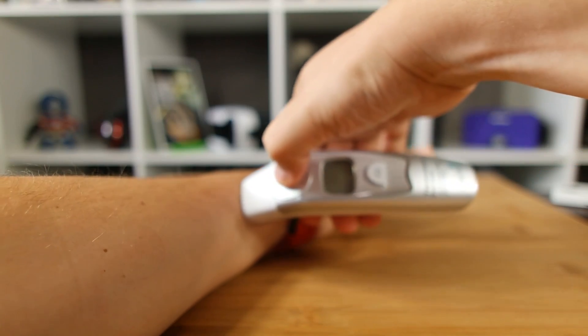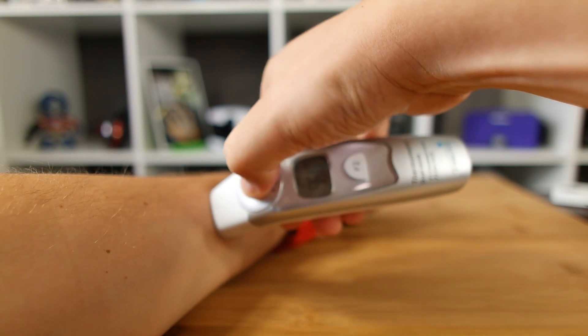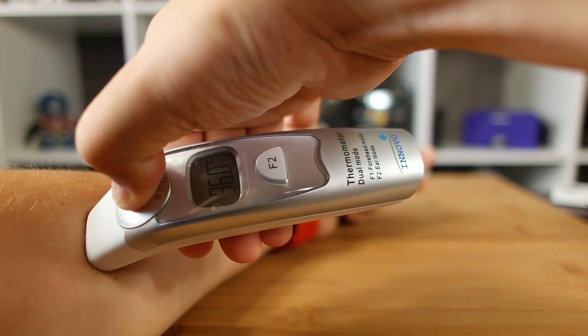Having tried a couple different infrared thermometers, Thermo is one of the fastest scanning solutions we've yet played with. Results also seem to be well within a 1 degree difference when compared to other solutions.